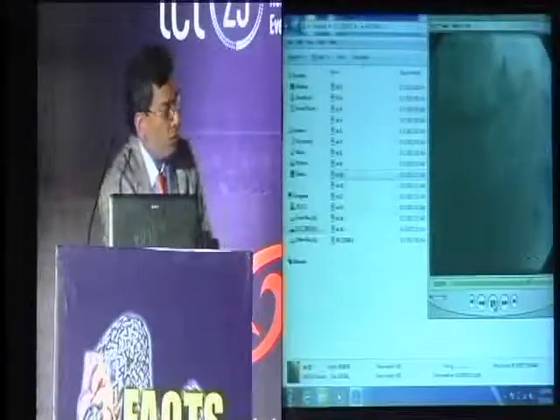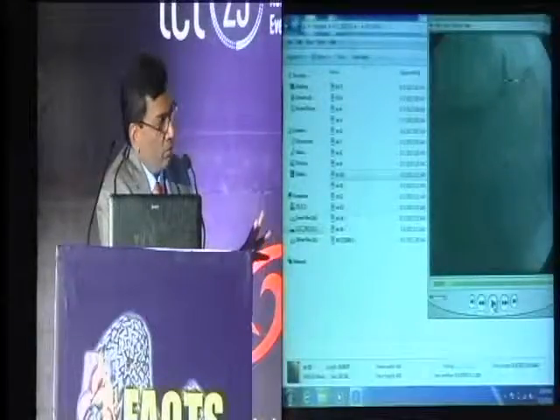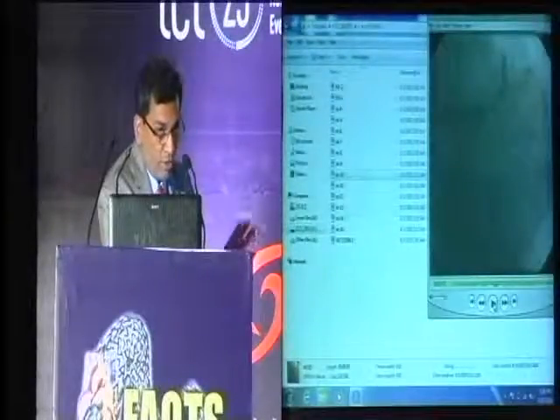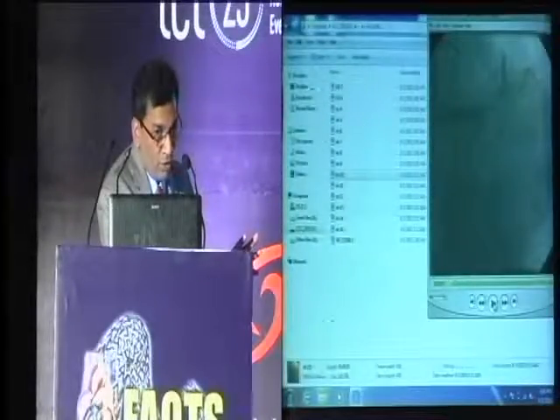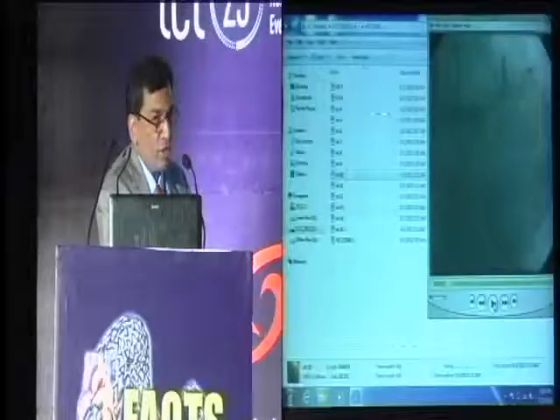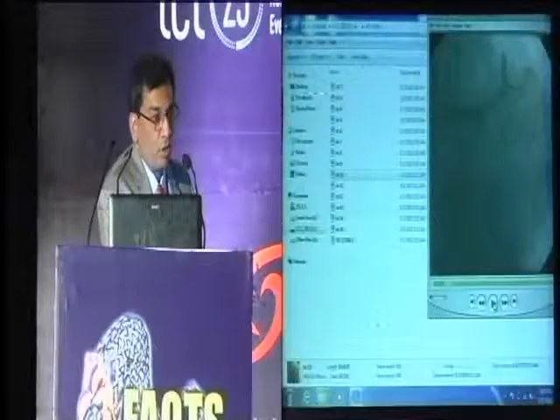Another aspect I want to point out is that after you have the bifurcation nicely open, you have to take multiple views to look at the bifurcation properly and decide where the takeoff of the diagonal is. That's key. Dr. Rath was pointing out different approaches to stenting, including V-stenting, T-stenting, mini crush, culotte technique, the TAP technique, and all those.